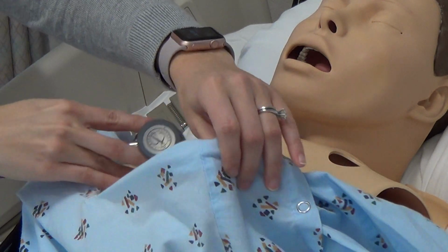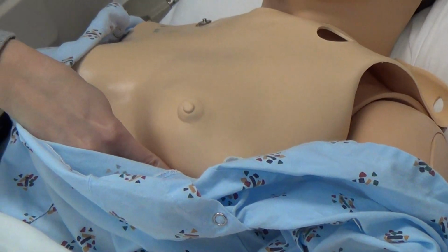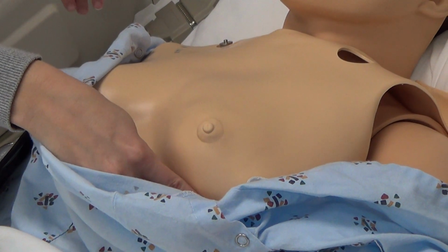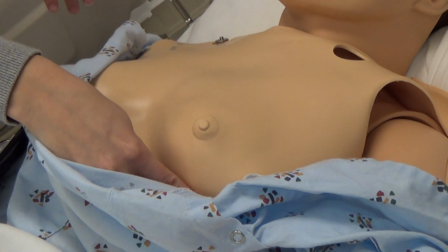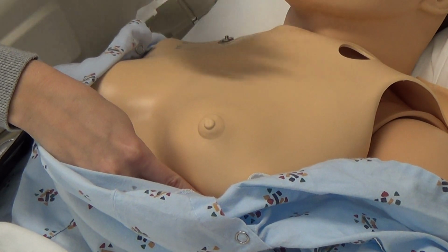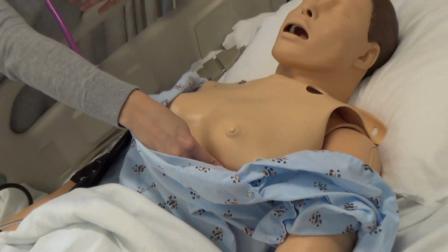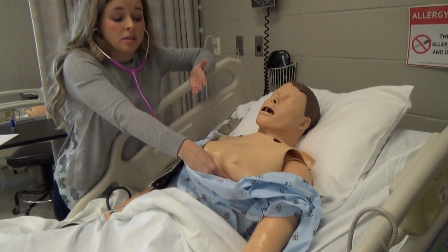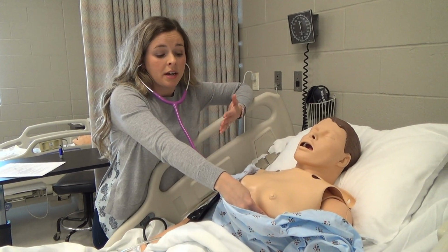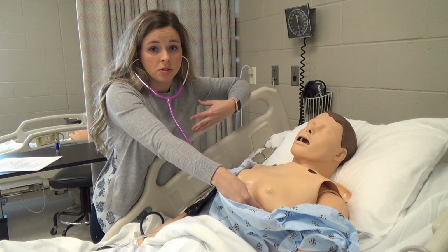And then the last one I'm going to listen to is the mitral valve, which is located also at the fifth intercostal space, but it is left of the midclavicular line, which is this line right about here. And this is also known as your apical pulse. This is where you can assess the patient's PMI. A lot of times medications will call for you to assess an apical pulse for 60 seconds. So this is where you would do that.